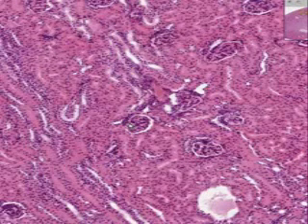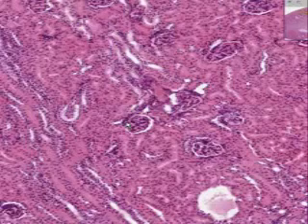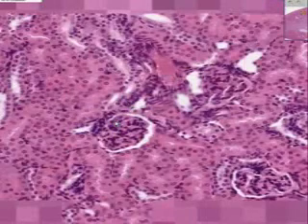I will also tell you that both the afferent and efferent blood vessels come into the kidney at the vascular pole, and it is usually impossible in real life to differentiate them from each other. But what you can differentiate are the fact that all these are proximal tubules here and here. Here's a distal tubule because it has a lumen.